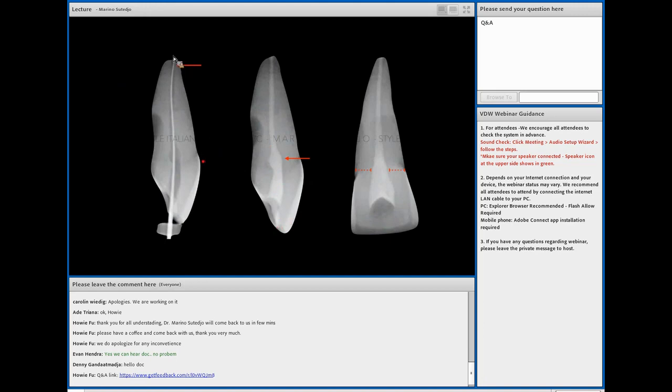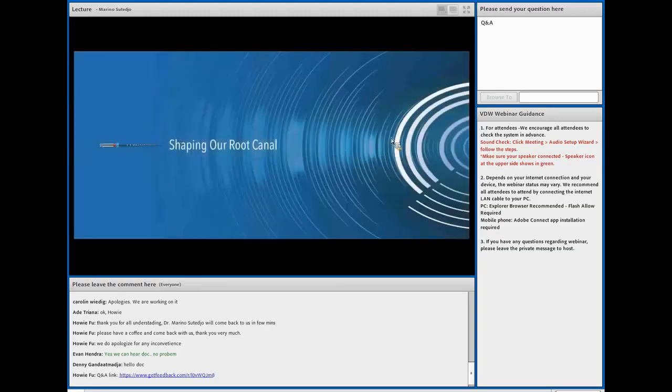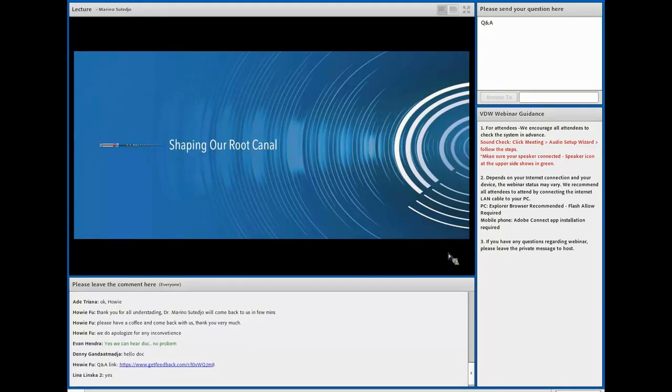And this is the outline form of the maxillary central incisor. As you can see, you can still do a conservative access cavity without forgetting the enlargement, and we can still gain apical control without any coronal interference at the coronal portions, and we can still maintain our pericervical dentin in a good way, as small as practical.